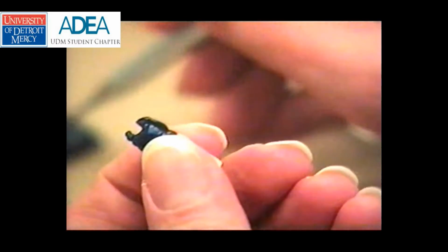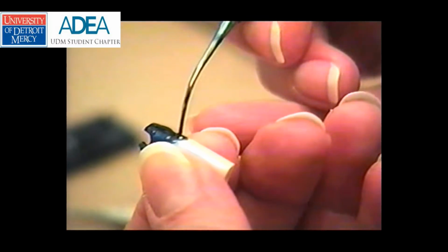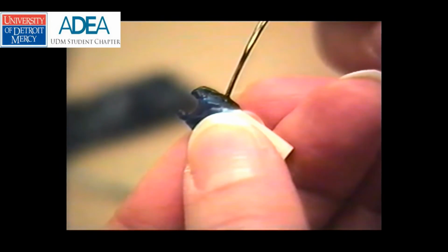Is this facial contour done? No, but we have a mark of where we want to end up. So we're in the ballpark. We have a frame of reference. And if you have a little frame of reference, then you can go on and fill in the blanks. I'll show you that in a sec.